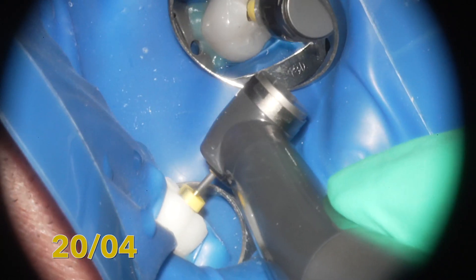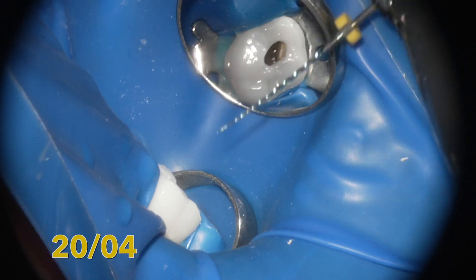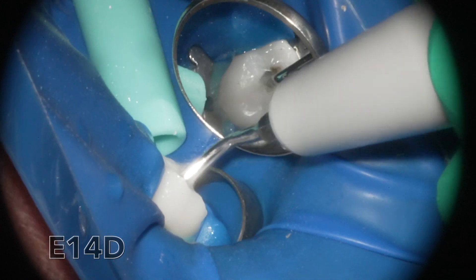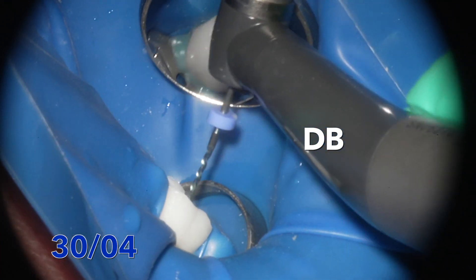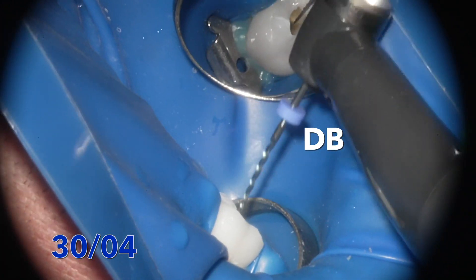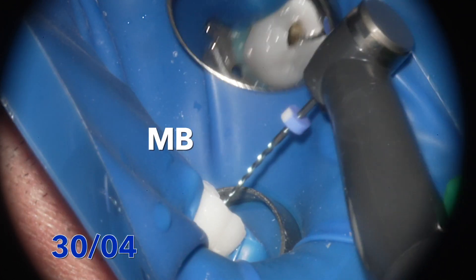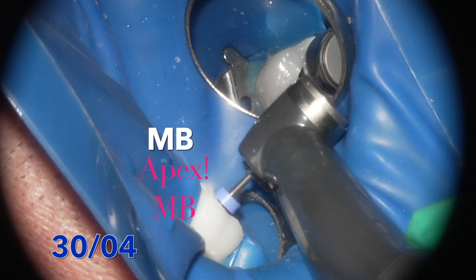The 20 04 is down to the apex on the distobuccal, so that canal is prepared to a size 20. The mesiobuccal is also prepared to size 20. Many people may prefer to fill these cases with a 20 04, but I prefer a larger apical preparation. I try to get the 30 down on the distobuccal, but the canal is gauged to a thinner diameter there. I don't force the 30 all the way to the apex in all of them, but on the mesiobuccal it did go down to the apex.